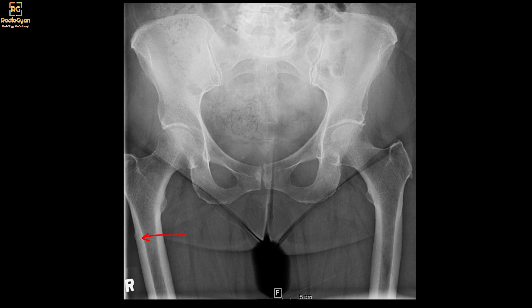This is an interesting point, because if we had recognized this fracture on the initial radiograph, we could have suggested prophylactic treatment. This is how atypical femoral fractures present — initially as a small cortical break along the lateral cortex of the subtrochanteric femur, and then later, whenever there's trivial trauma, they can present with a displaced non-comminuted fracture, as we saw in our case.